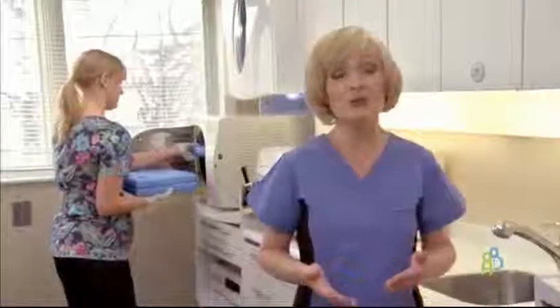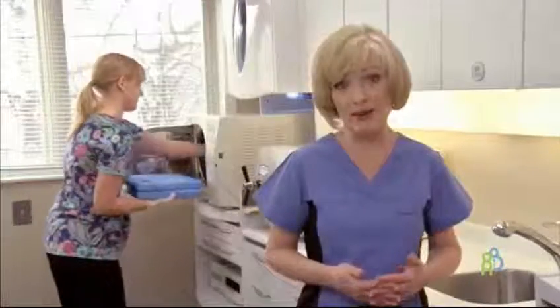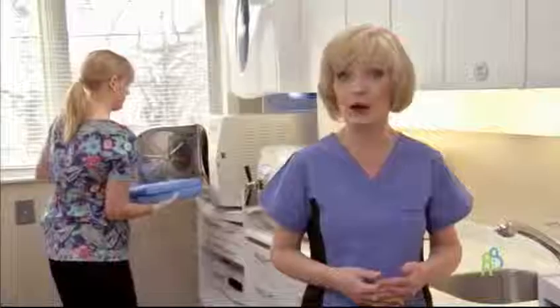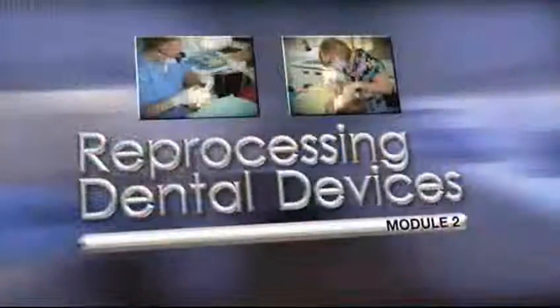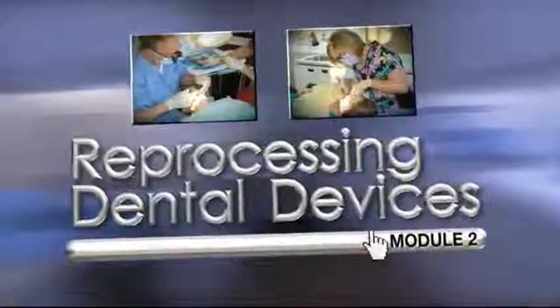Now that you're aware of the proper PPE you should be wearing and have an overview of the reprocessing process, please proceed to Module 2, where you'll learn about the proper procedures for cleaning and preparing instruments for sterilization.